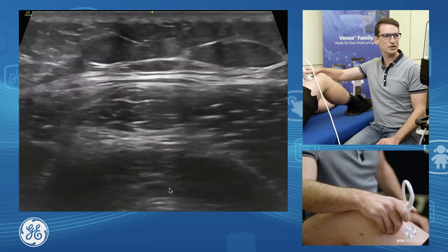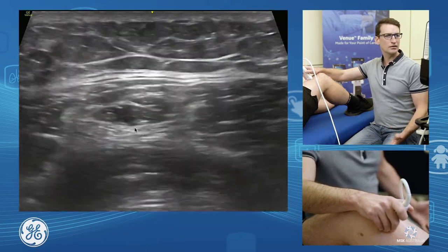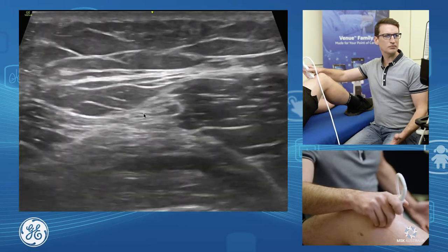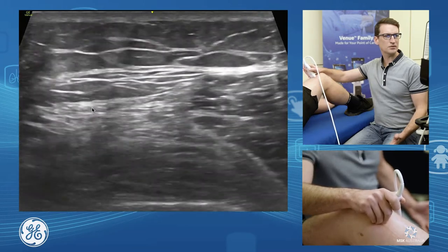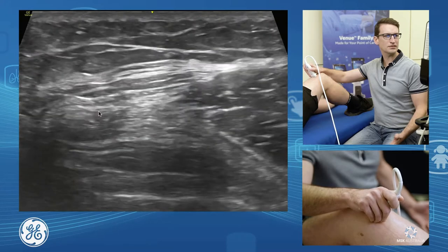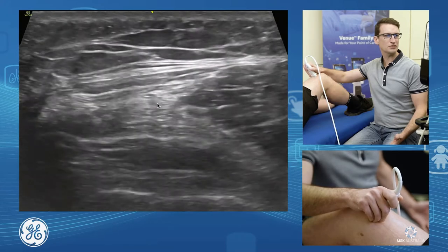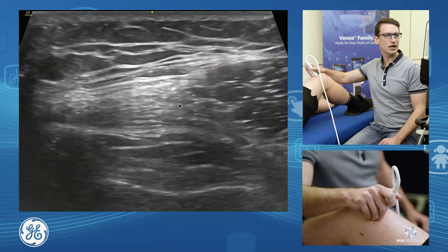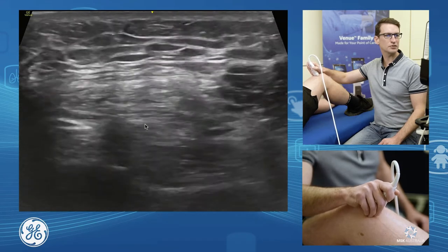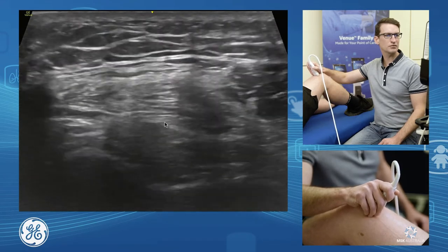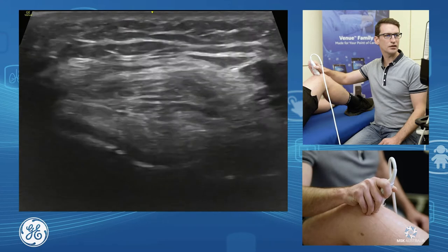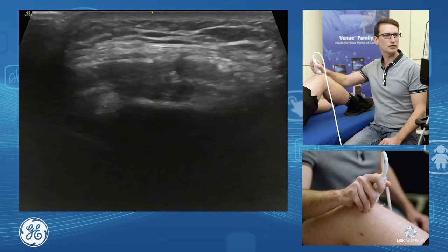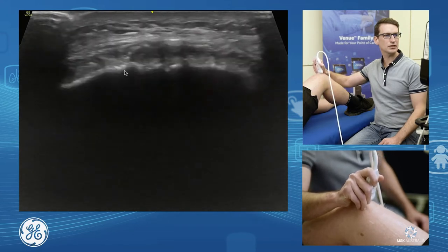If we follow this down, we'll see our rectus femoris form its tendon, sitting over the top. Our vastus lateralis and medialis will form a common tendon underneath, and our intermedialis will be our lower one. So we can see those three layers, and they will come all the way down onto our patella.